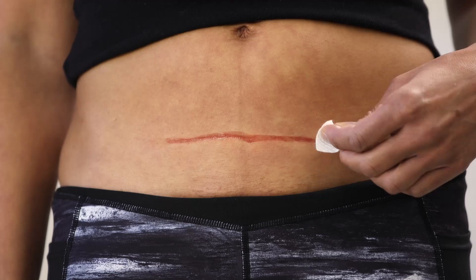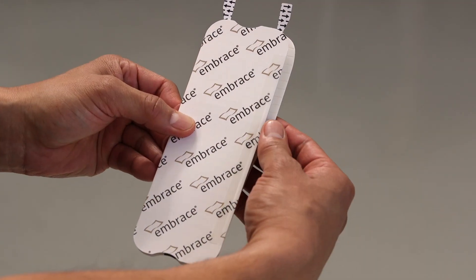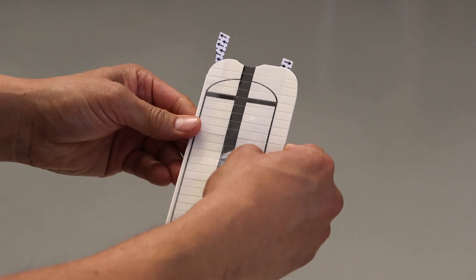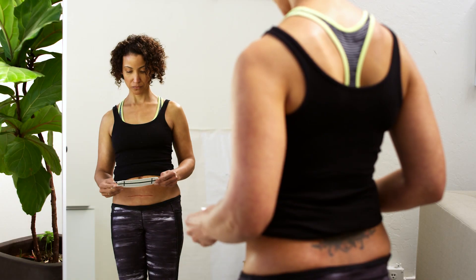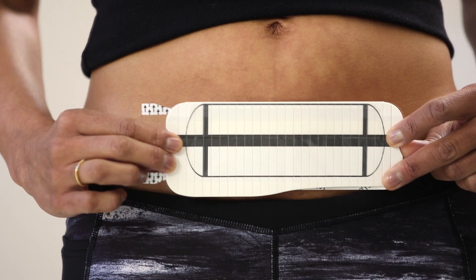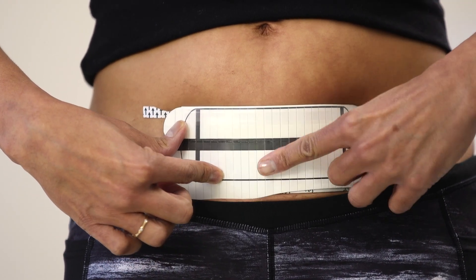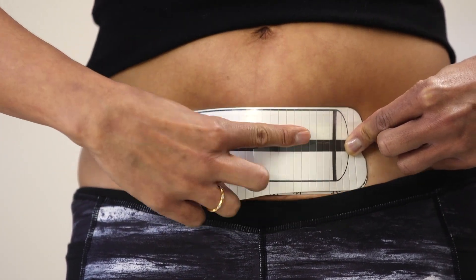Be sure to allow your skin to dry before applying Embrace. To begin, place your thumbs in the middle of the applicator and gently open, folding the side of the applicator with a dark stripe all the way back. Be careful not to touch the exposed adhesive. Using the dark stripe to help center the dressing over the scar, position the applicator with the dark stripe facing away from your body. The dark stripe is only a reference guide. If your scar does not exactly align with Embrace, this is okay.